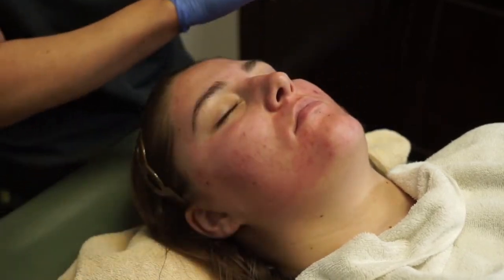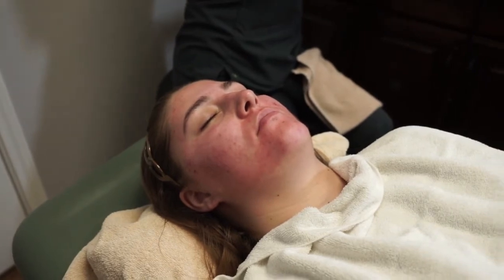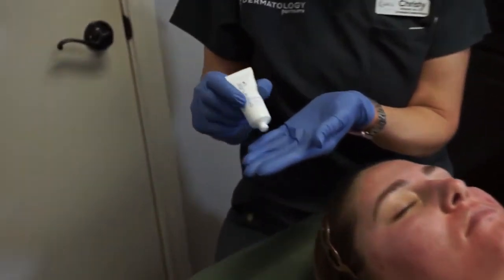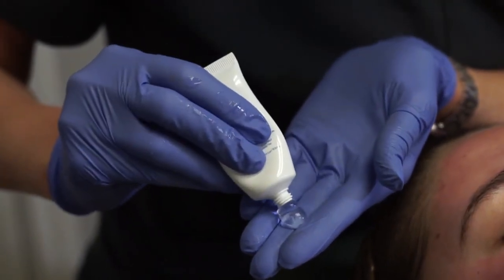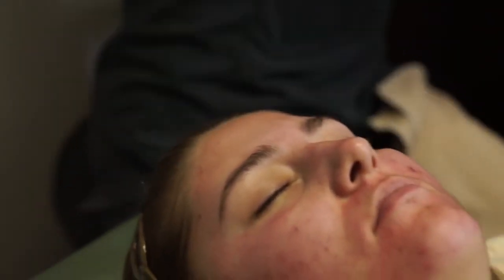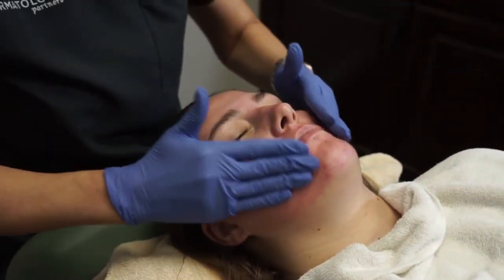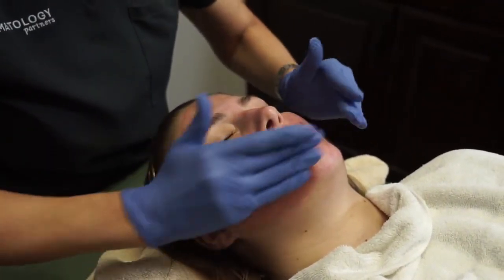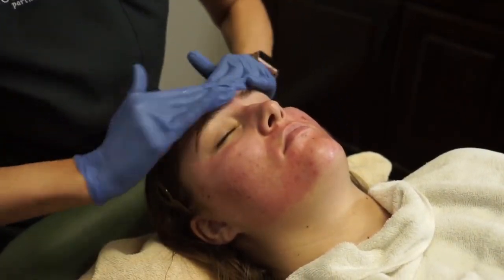Also, provide the patient with the 1-ounce tube of Rescue Calming Complex, which can be used beyond 24 hours post-procedure. Advise patient to avoid sweaty exercise and sun exposure for 72 hours post-procedure. It is recommended to avoid other facial aesthetic treatments the month following the SkinPen Precision treatment. Before the patient departs, make sure to schedule their next appointment in 4 weeks.